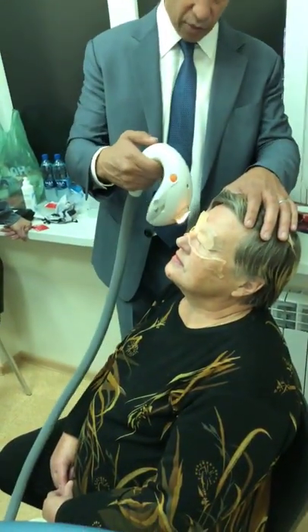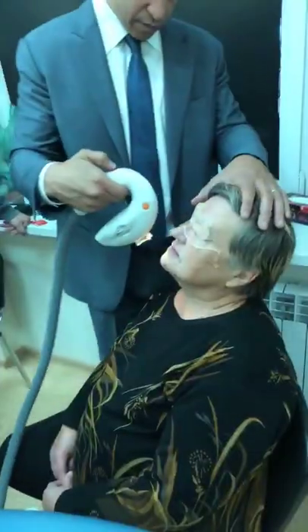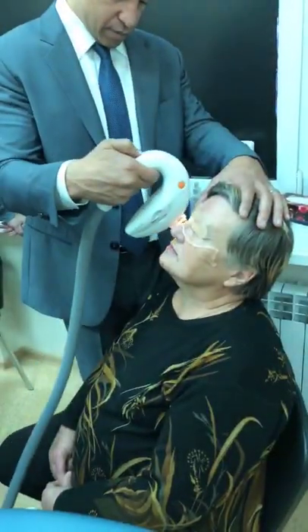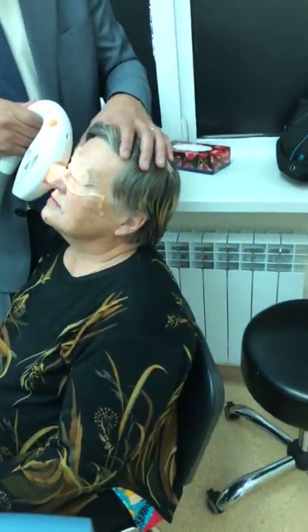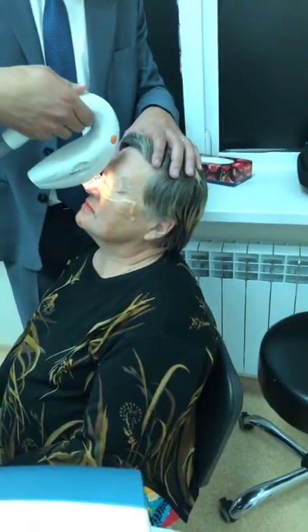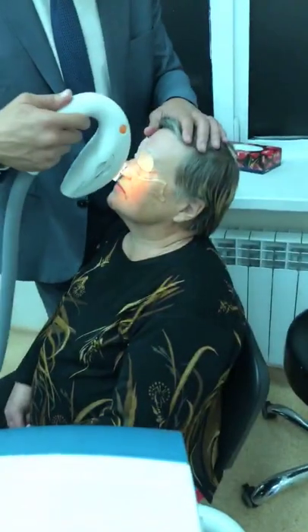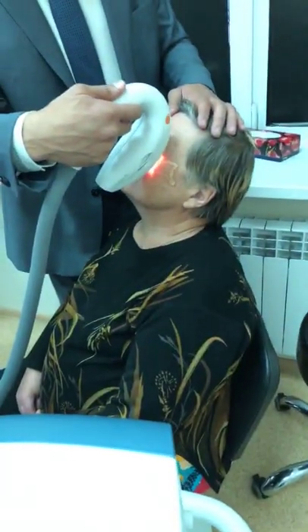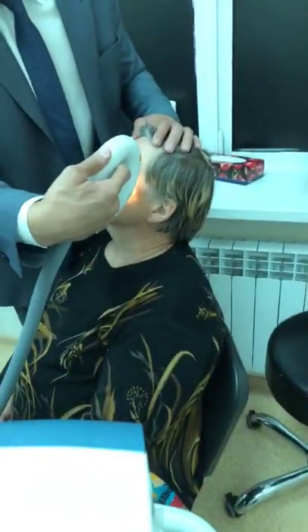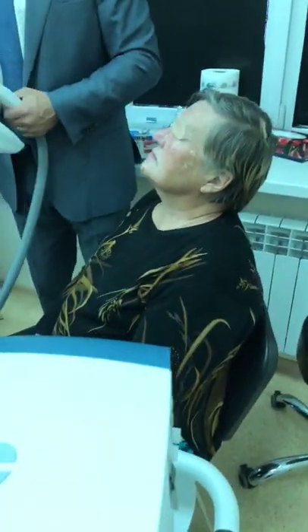So the important shots are right here at the lid margin. So you want to get right at the lid margin, and these parameters are completely safe to do on the lid margin. Ask her how she's doing.